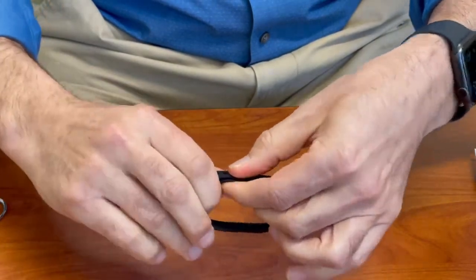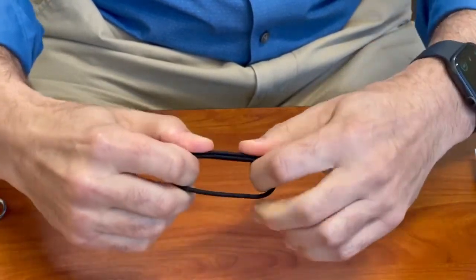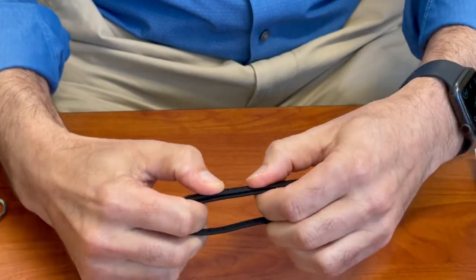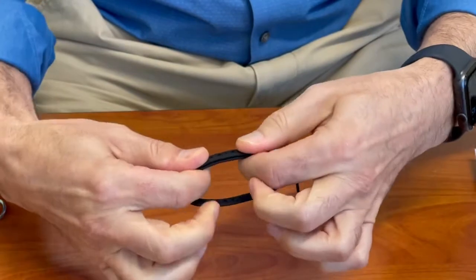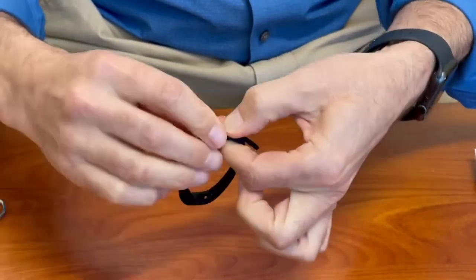We then form the rigid zone, which is the doubled over portion of the splint. Continue to wrap that around, keeping the bands adjacent to each other.